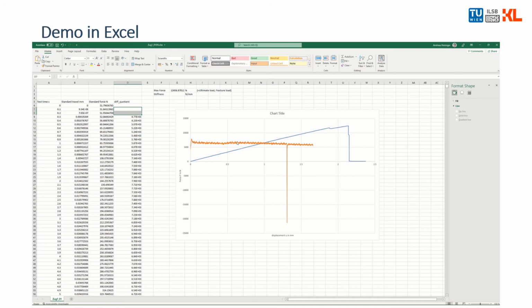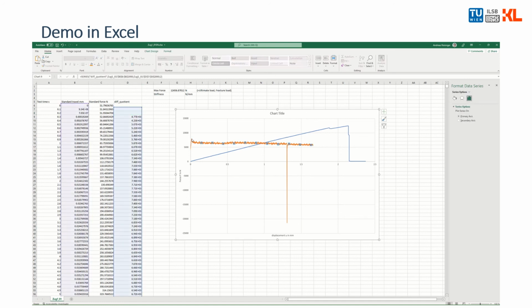We see a slight decrease over time. There is some drop here. You see a flat spot here, and this is indicated by this drop of slope, and this goes on. The thing is now, when we determine the maximum slope, so we take the maximum value of the differential quotient, we would get this slope here at this point.